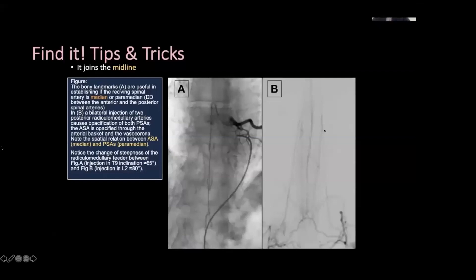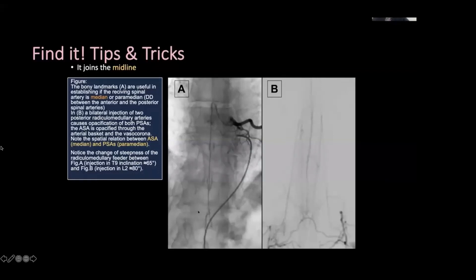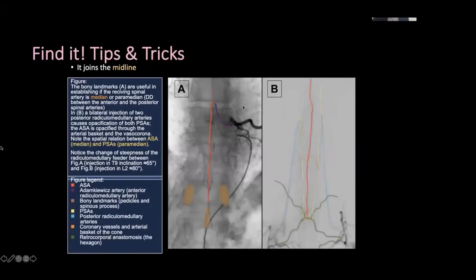Here you can see the anterior spinal artery coursing down. The anterior spinal artery is supplied by multiple radicular medullary feeders in a stepwise process, and you lose more and more of these feeders as you get older. Higher up at Adamkiewicz and then lower down, the anterior spinal artery — which is contiguous all the way down — ends in what we call the basket, which is contiguous with the paired posterior spinal arteries, also fed by radicular medullary feeders.